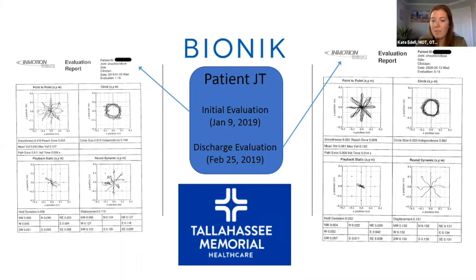But your example of taking Kim's report and submitting it to insurance is obvious that it does work, and it's very easy. But Sheree, I know that we've got this question before, so I'll let you tell us your thoughts on the documentation and what they should do. Yeah, this is actually one of the common questions that we get, only because everybody wants to be able to report exactly what they did. I mean, that's how we get paid, but it's also how we show improvement with patients. And if you can't do that, that becomes a bit of a problem.